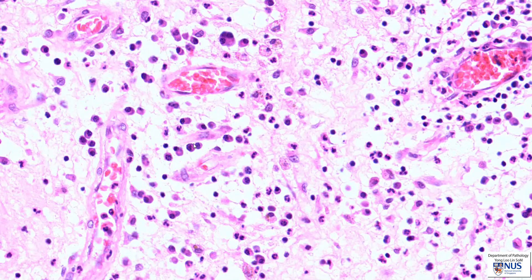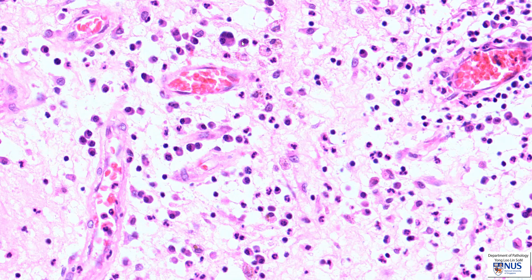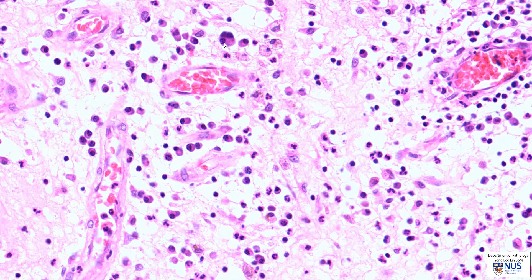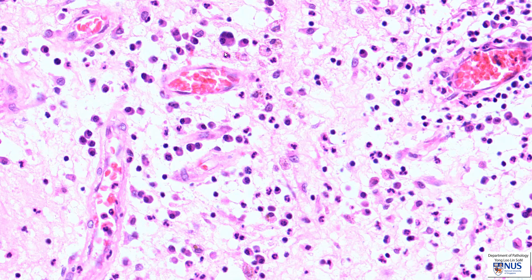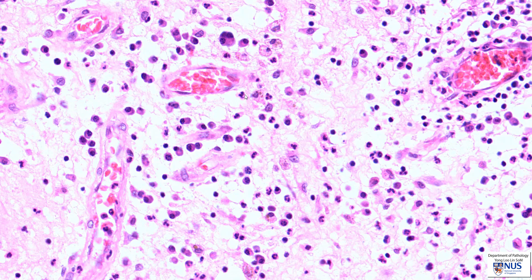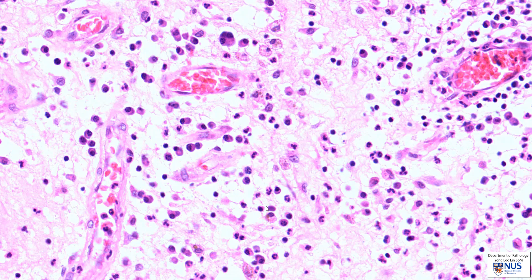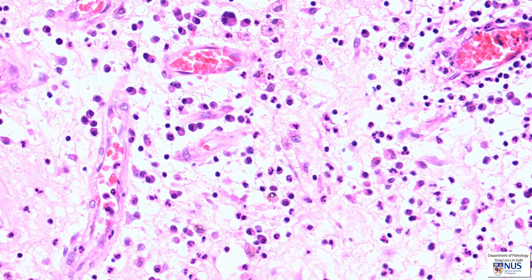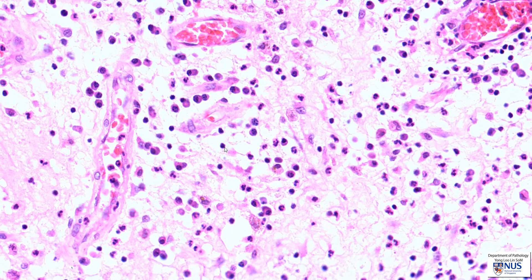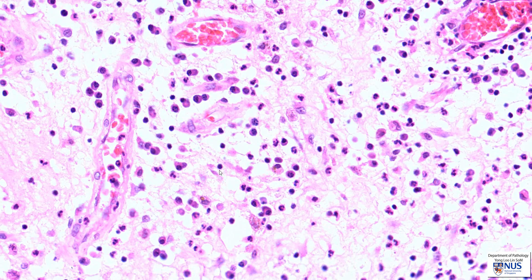There are some plasma cells with eccentric nuclei. We have a binucleated one here. There are also neutrophils, which are part of acute inflammation, and also lymphocytes, as you can see here and here.